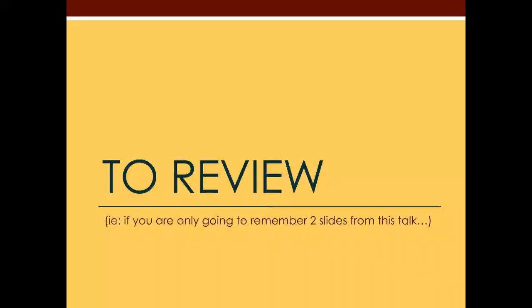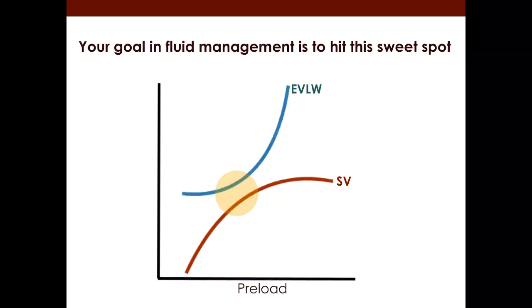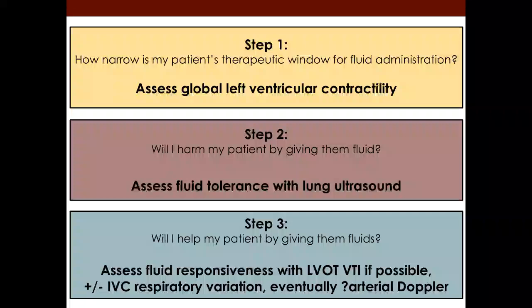All right, to review. If you're only going to remember 2 slides from this talk, this is your goal in fluid management, to hit this sweet spot. And these are the 3 ultrasound steps that you're going to do to try and figure that out.